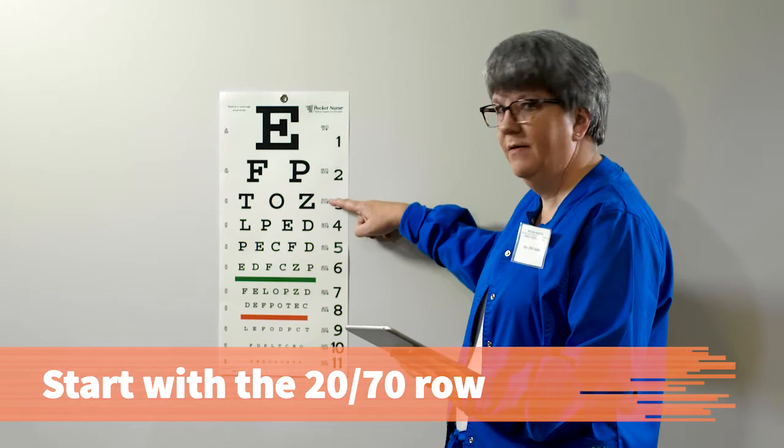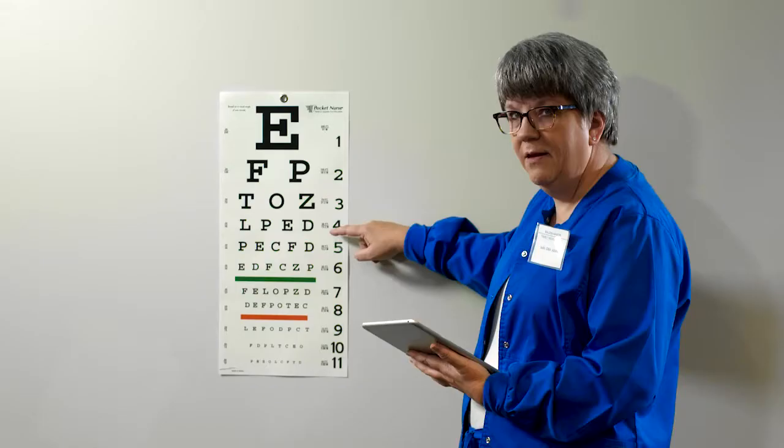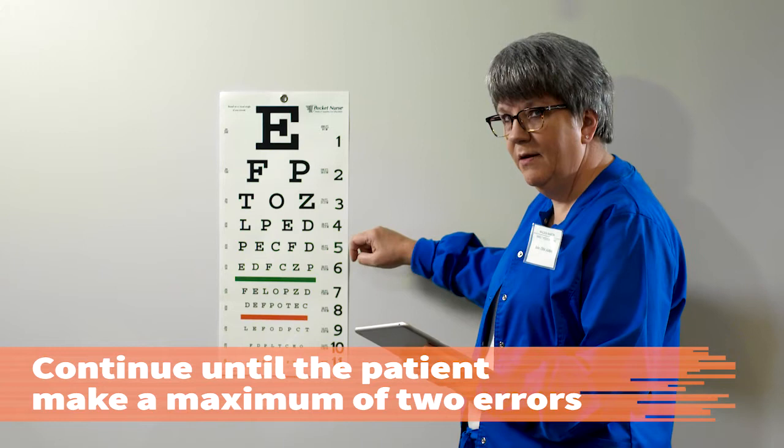Position the patient in a standing or sitting position at the 20-foot marker and check that the Snellen chart is at the patient's eye level. Stand beside the chart and point to each row, having the patient read it aloud starting with the 20-70 row. L-P-E-D. Starting with larger letters gives the patient confidence and allows her vision to adjust before moving to the smaller letters.